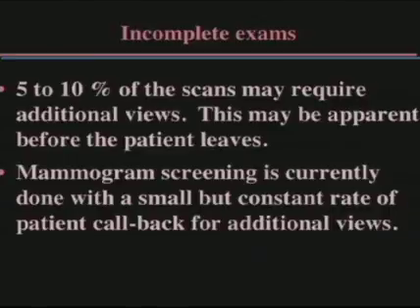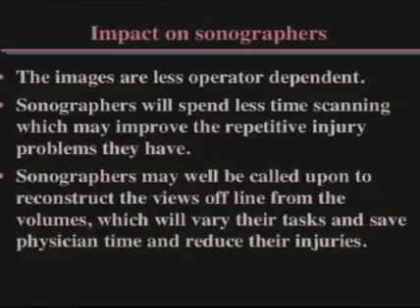And of course, this type of scanning can be done as a screening type. I'm not advocating this for high-risk patients. The impact on sonographers, I think, is going to be very important. The images are going to be less operator dependent. Sonographers will spend less time scanning, and this may improve some of the repetitive injury problems that they deal with long term. And then the sonographer can be called upon to reconstruct the views offline, and that will vary their task and hopefully reduce their injuries.